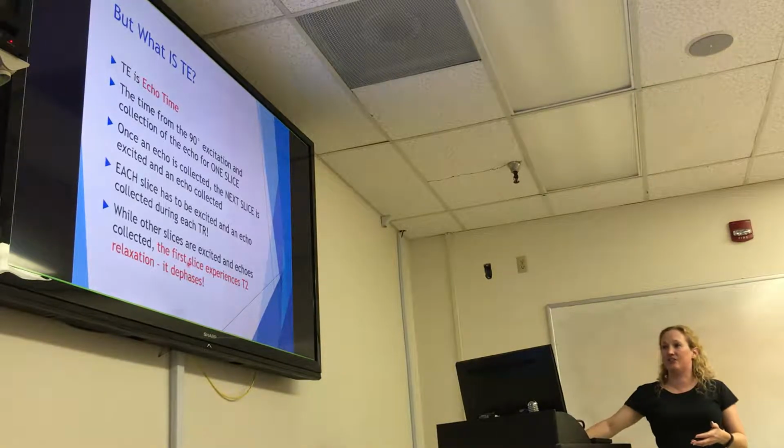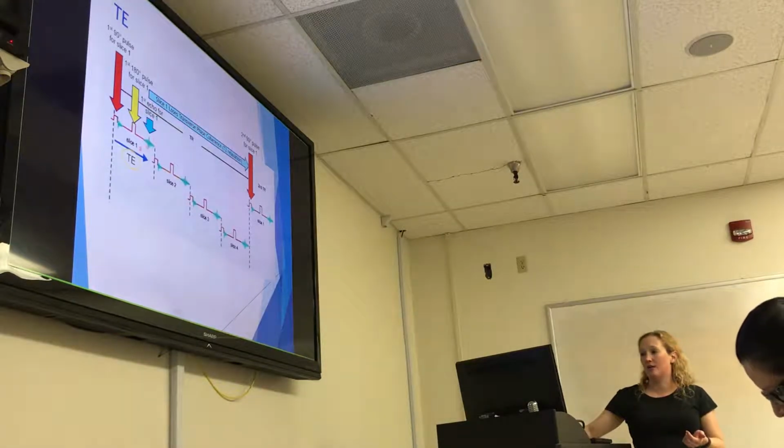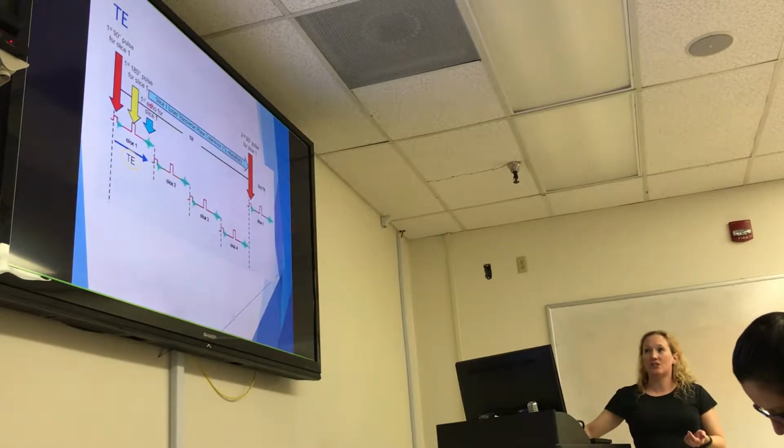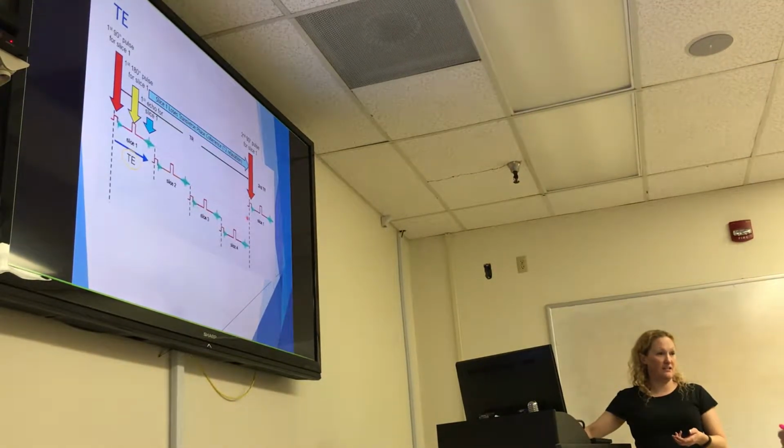So let's look at this image again. Same as before, here we did slice 1, excitation, 180, and echo. This time here is our echo time. It's the time from when we excited it to when we collected our echo. But notice we have multiple ones of these in our TR, right?